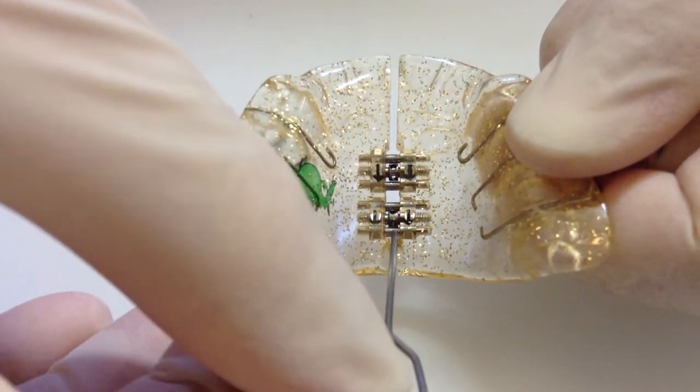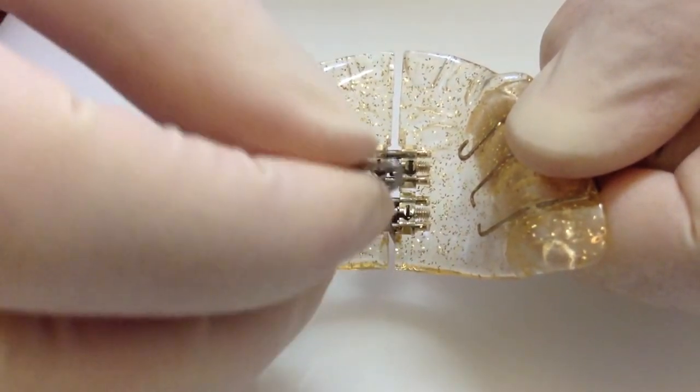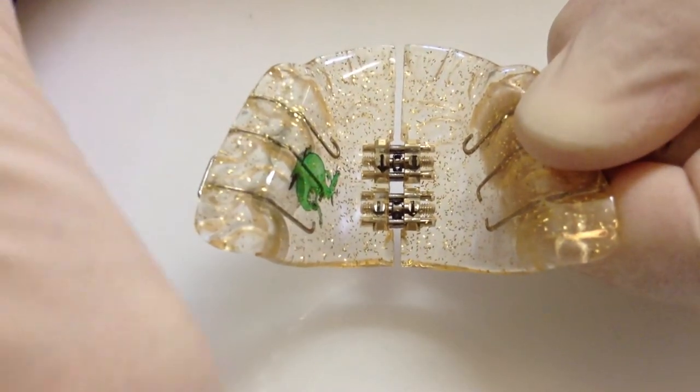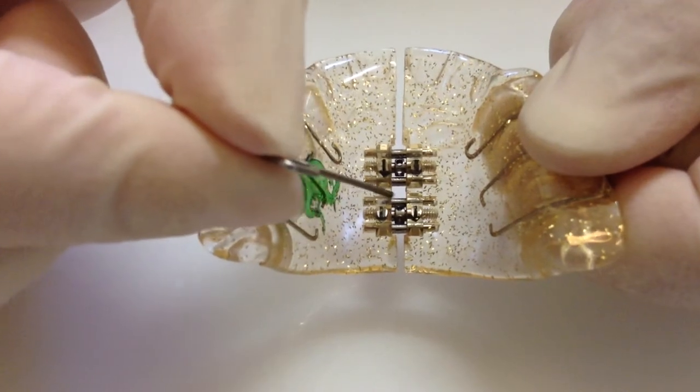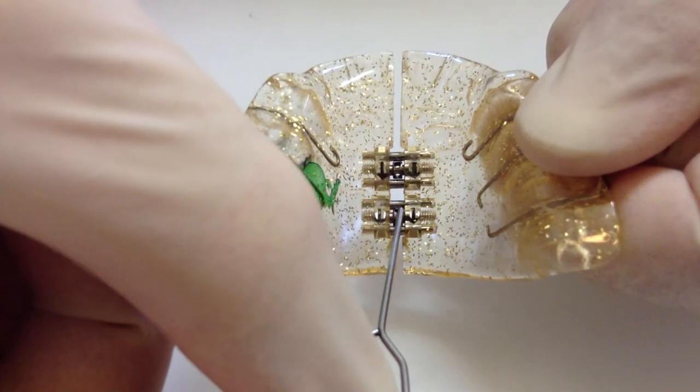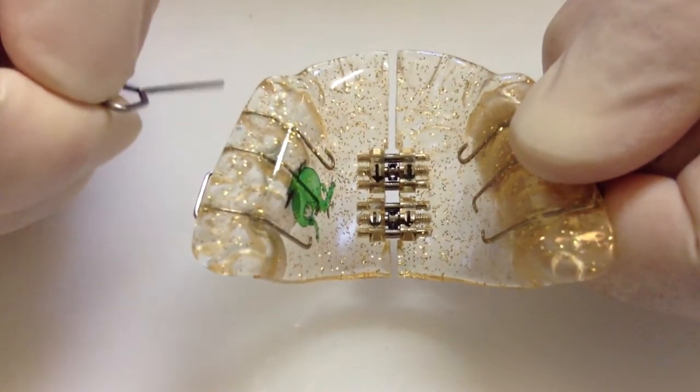Make sure when you remove the key, you don't accidentally turn it back slightly. You want to make sure it's all the way, and then remove it. If you cannot see the next hole, you haven't turned the key all the way. You've now expanded your plate.